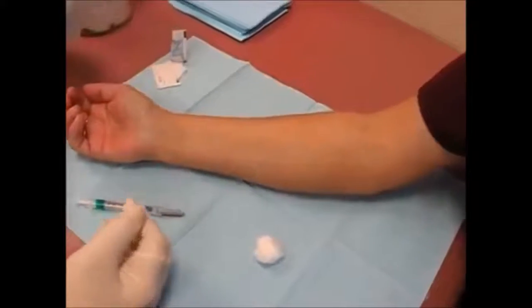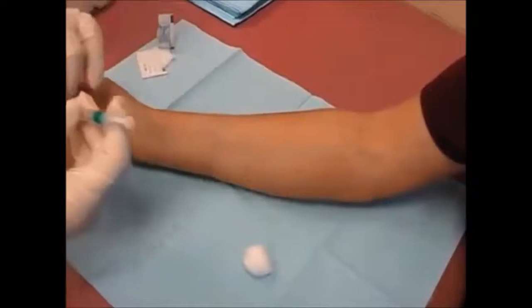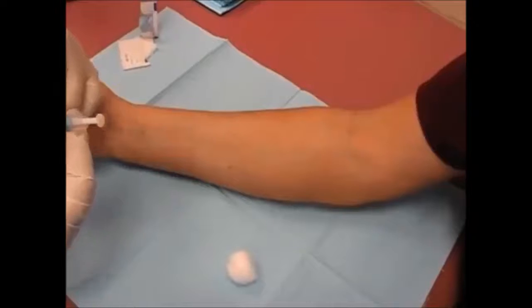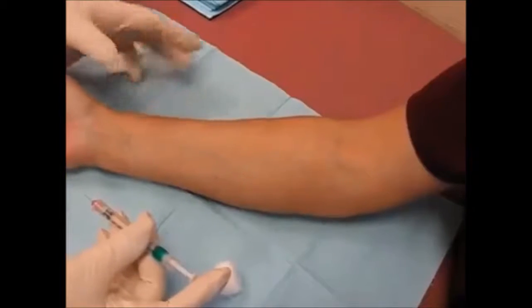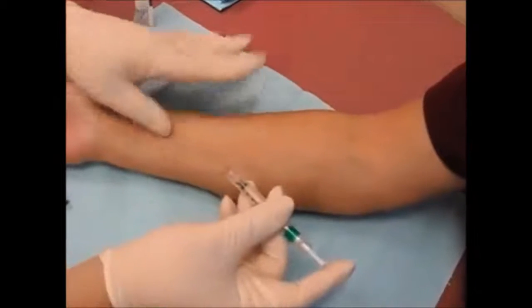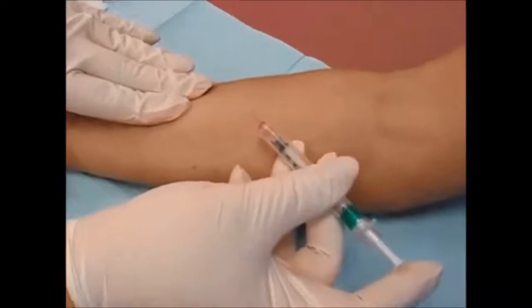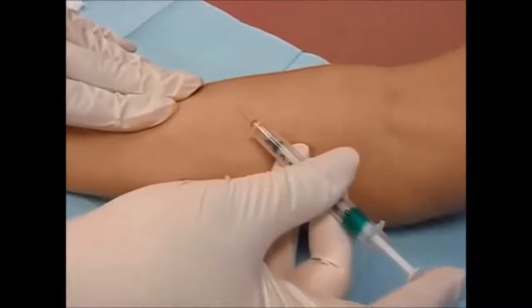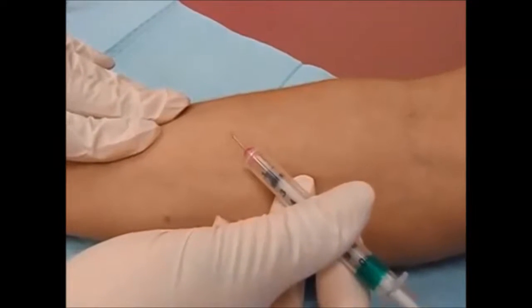Now, the way I prefer to do this is I'm going to come in at this angle using a one-handed technique. The most important aspect of this injection is angle, as little angle as possible. I'm going to hold the skin nice and tight using my non-dominant hand. With the bevel up, the bevel has to be up at all times. I'm going to place the bevel just under the surface of the skin. Do you see how you can almost see the needle under the skin there?